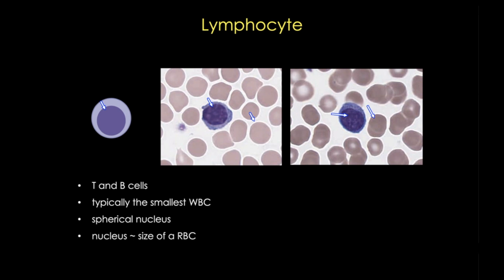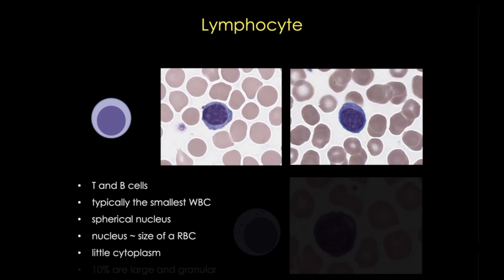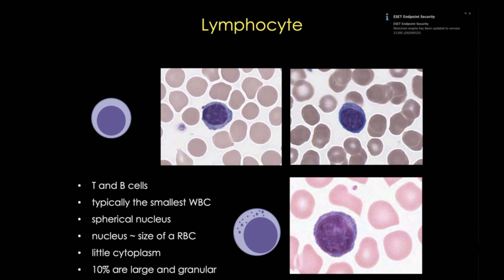Small lymphocytes typically have a nucleus roughly the same size as a red blood cell. Lymphocytes usually only have a thin surrounding rim of scant cytoplasm, and this cytoplasm is usually basophilic or blue. The larger lymphocytes, which are fewer, have nuclei larger than red blood cells and typically more cytoplasm — sometimes even a few pale blue granules or lysosomes. Importantly, the nucleus is still spherical, which allows us to distinguish this cell from monocytes and other white blood cells.